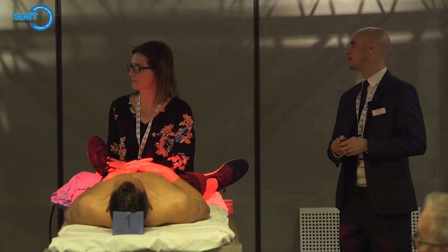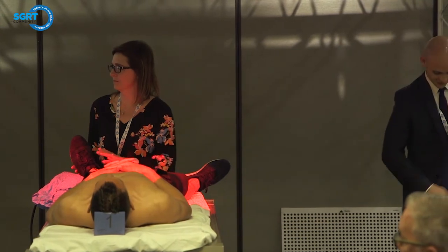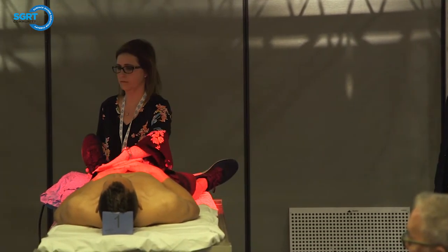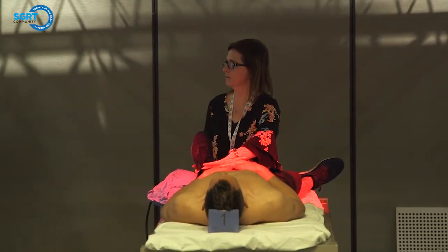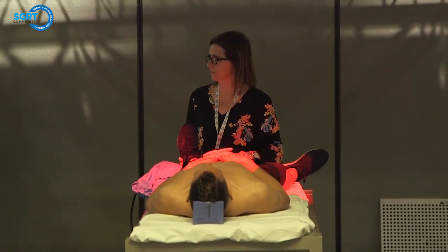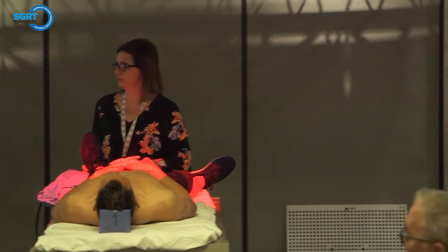Whoa, she's getting there quick. I know. So if you notice, she actually rotated the knee. Why? Because that's where the ROI is, right? All of our deltas are derived from the region of interest, so that was a very smart move.